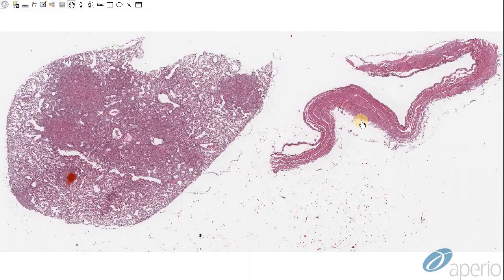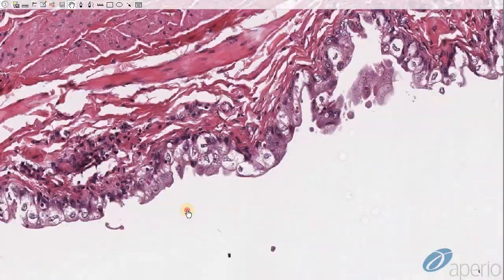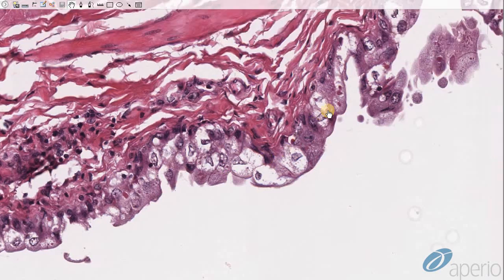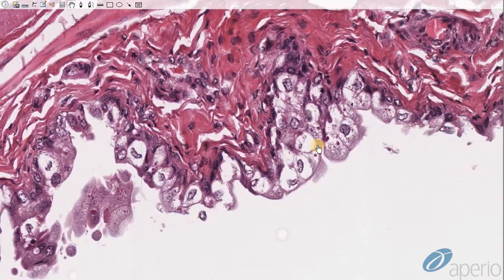Canine distemper can also infect the urinary bladder, which is a good site to detect intranuclear and intracytoplasmic inclusions. In this dog, we can see bronchopneumonia similar to the previous video but less severe. The urothelium of the bladder is degenerate and sometimes sloughed, with evidence of intranuclear and intracytoplasmic inclusions, as well as ballooning degeneration of the epithelium.